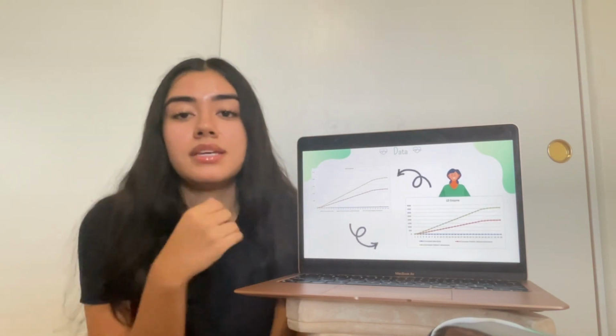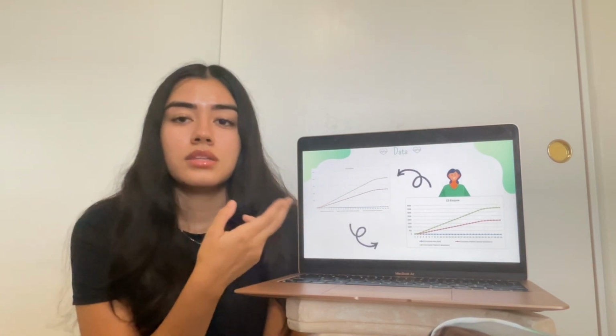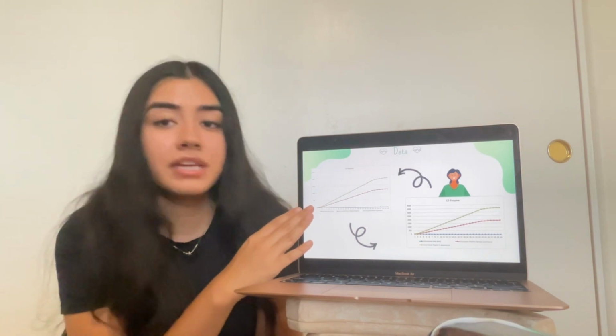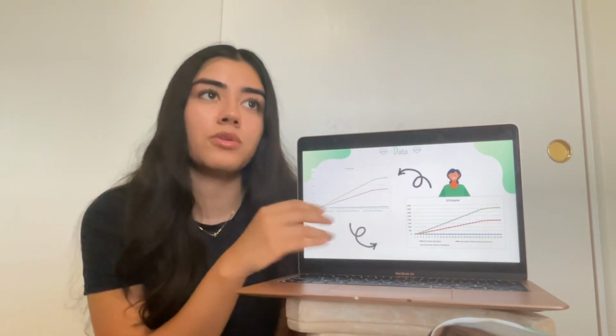Here you can see the data that has been collected. To go in depth, the chart, the graph and value for the CK levels presented in the patient is in normal range. As for the LD levels presented in the patient, they fall below normal range.